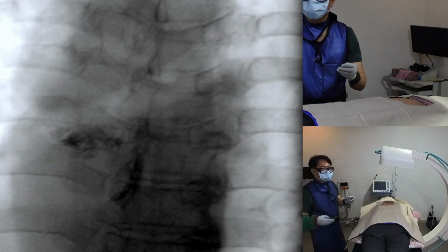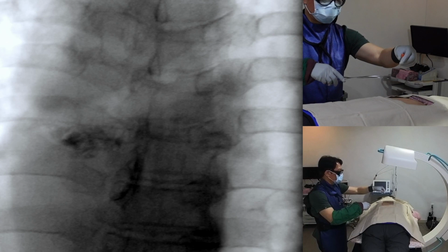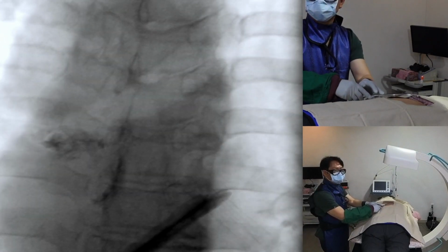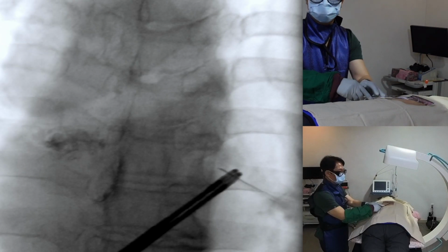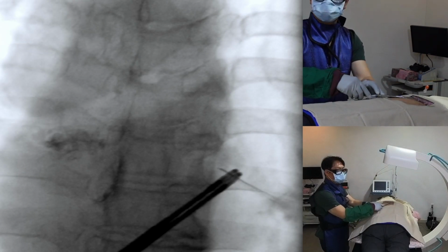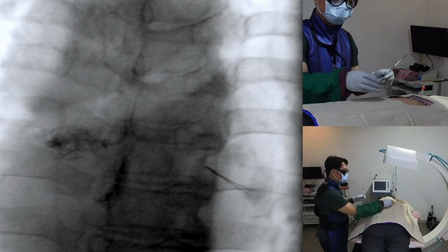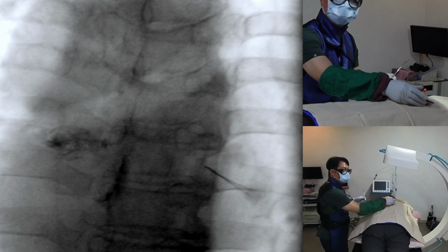Next, I proceed with the right T8 transforaminal approach, using the same technique and finding the space between the inferior lateral border of the lamina and the upper border of the medial end of the rib. In most cases, you cannot see the clear pedicle and lamina in the thoracic spine compared to the lumbar or cervical spine.